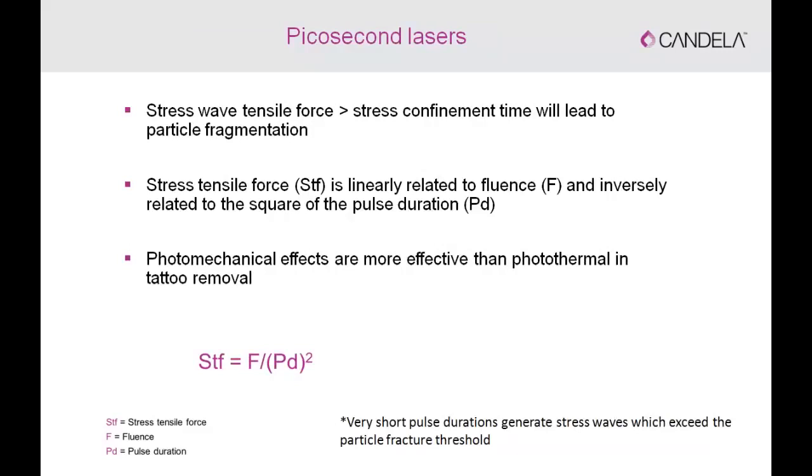But for the same fluence, if you shorten the pulse duration, you would have a much higher stress tensile force that will then exceed the stress confinement time, and that leads to particle fragmentation. And this is why with the short pulse durations of the picosecond lasers, we have much more of a photoacoustic or photomechanical effect, therefore much more shattering effect with less photothermal effect, which again means higher efficacy as well as safety and less pain and discomfort to the patient.